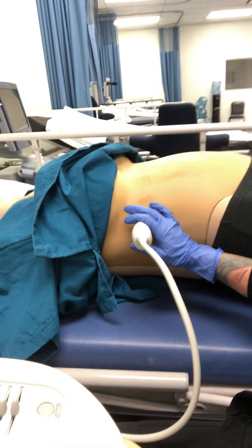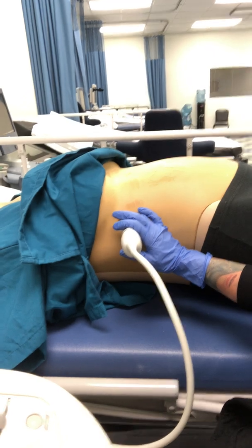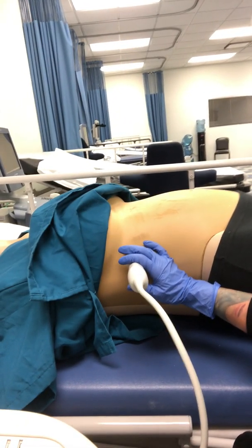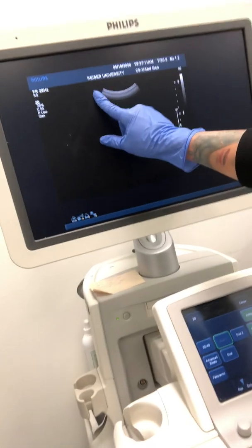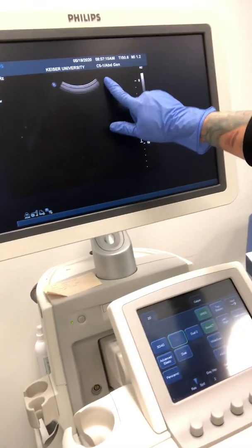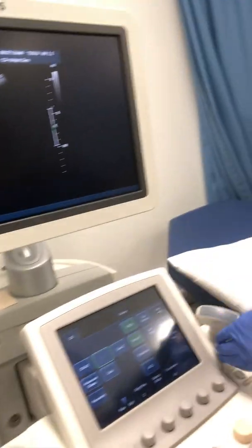So if that's the case, the notch and the indicator would both correlate posterior for this patient, which would make the exact opposite true on the other side or the right-hand side of our screen. So if we look at our screen, again, our indicator would be pointing towards the patient's back because so is our notch, so posterior. And then the opposite side or the right-hand side of the screen would be pointing anterior.